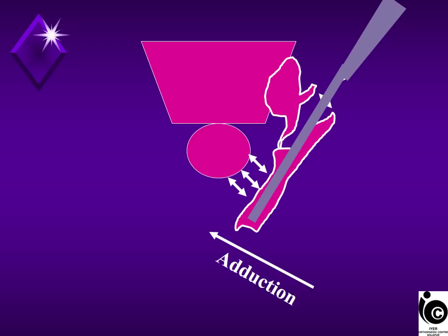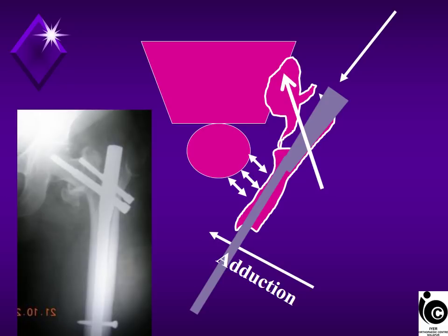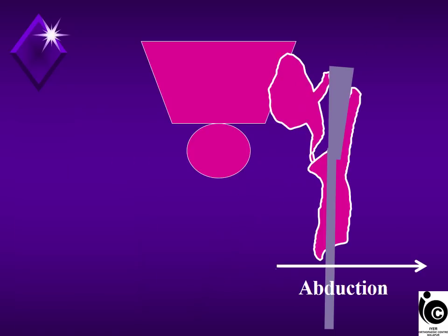Then the surgeon inserts the nail, and now does the locking. If he does the locking in the same position, as you can see, the fracture has been fixed in varus, as shown in this picture. But if the surgeon abducts it to get the neck shaft angle proper, the fracture opens up medially also.